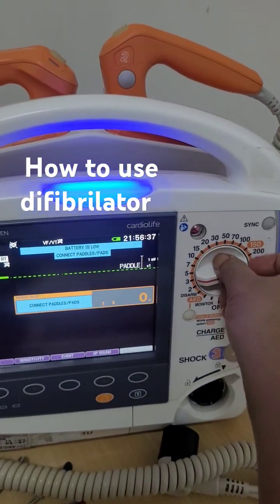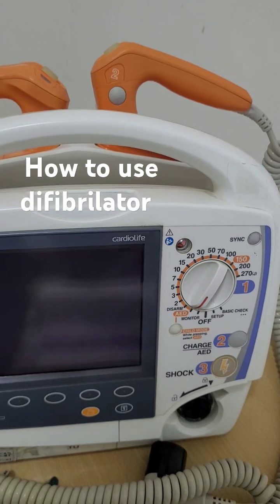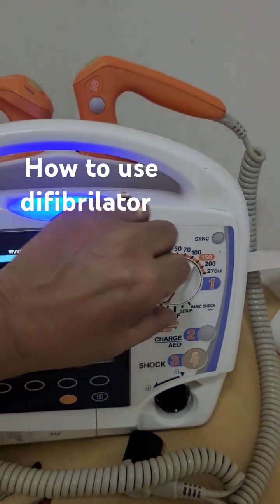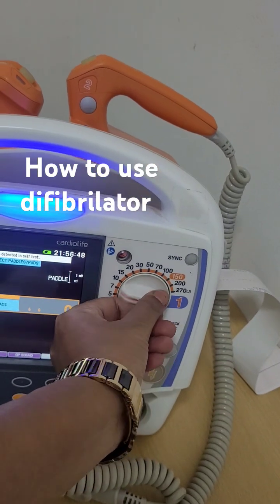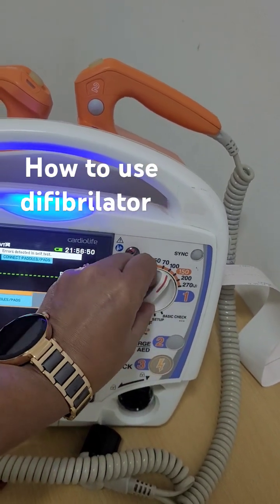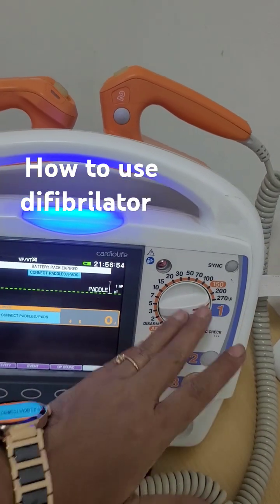It's very simple. You just have to turn it on. You have to select adult mode, use disposable pads, turn it on, and then you just select the energy - whatever energy you want to select. During CPR, you select the maximum level energy.